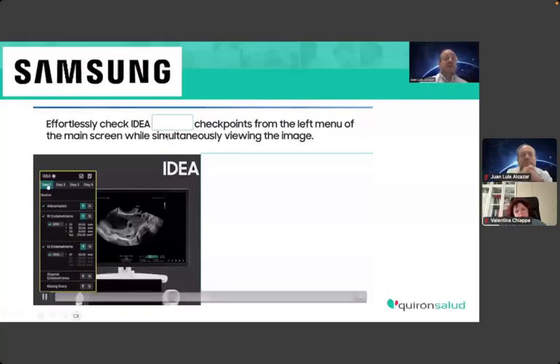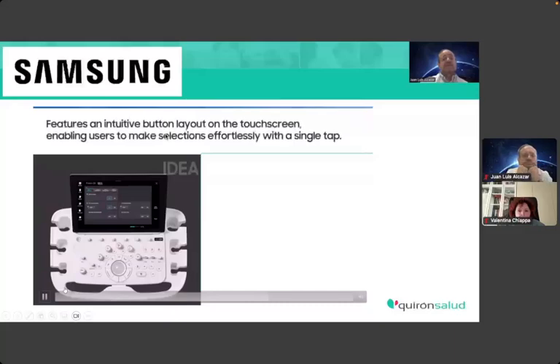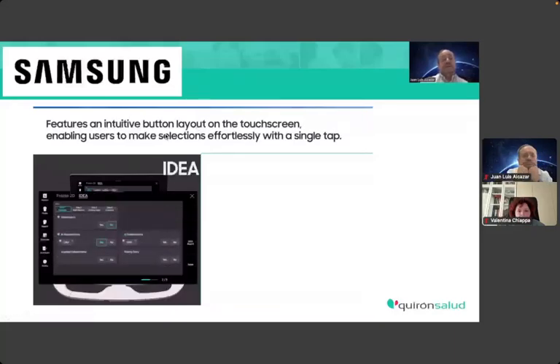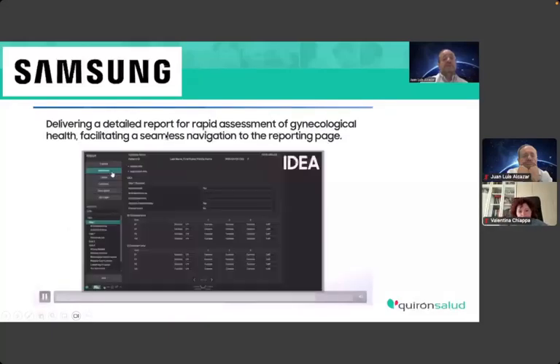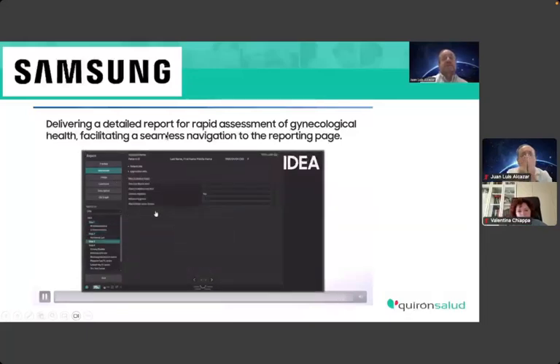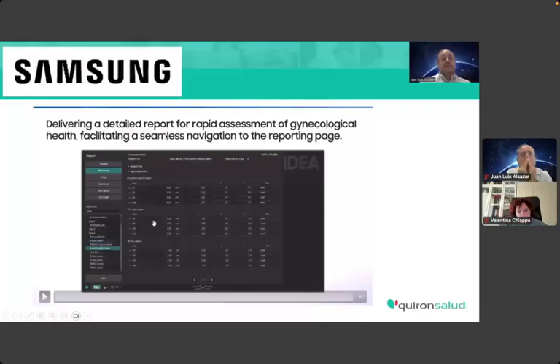You see here, step 1, you can observe the presence of adenomyosis, the right or left endometrioma, typical or atypical, also the kissing ovary, which is also a soft marker. Then you can measure the size of the lesions, and you also can go for as many endometriomas as could exist.